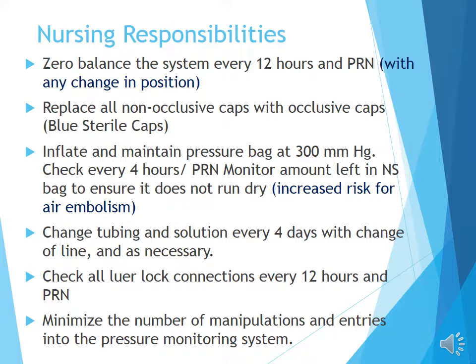And then minimize the number of manipulations and entries into the pressure monitoring system. Try to make sure that it stays in place because they often go bad, and the patient can have a lot of bleeding and issues if there's circulation issues going on.